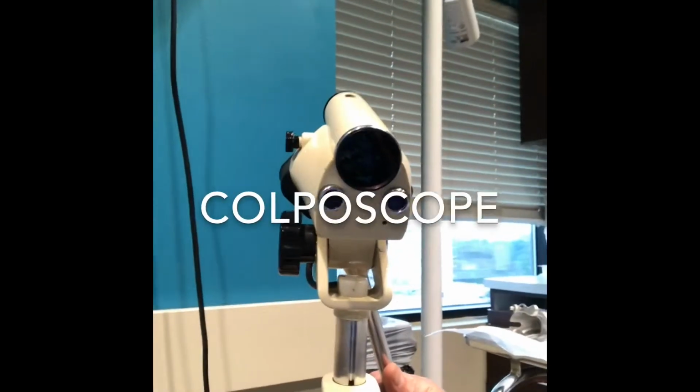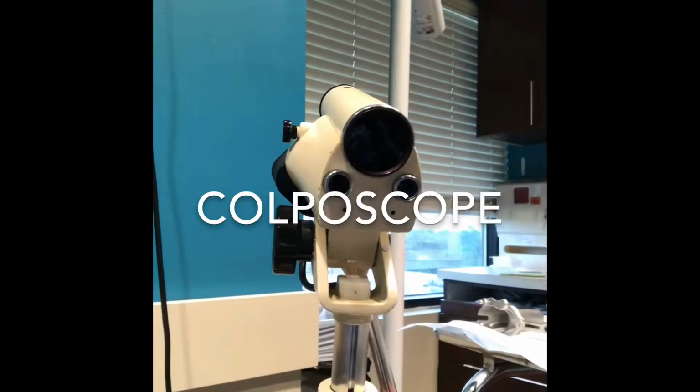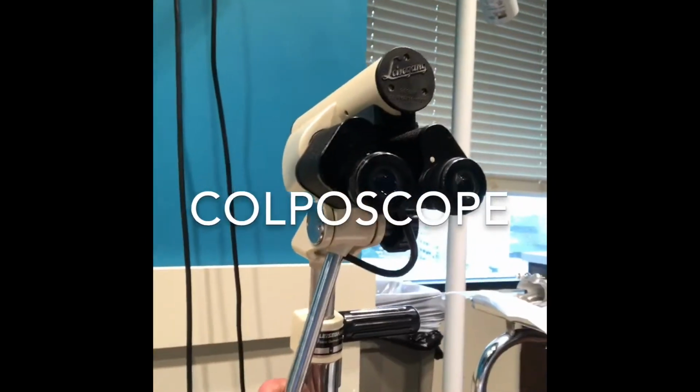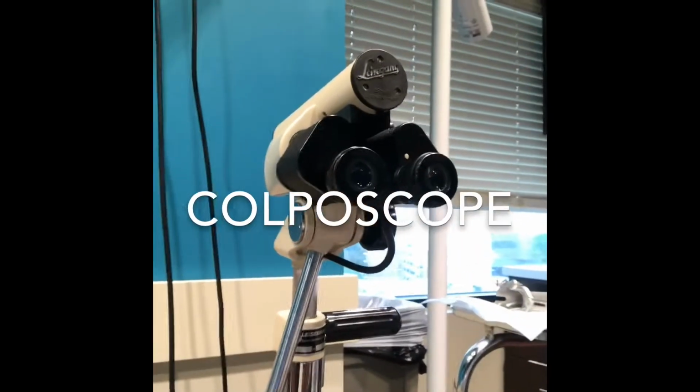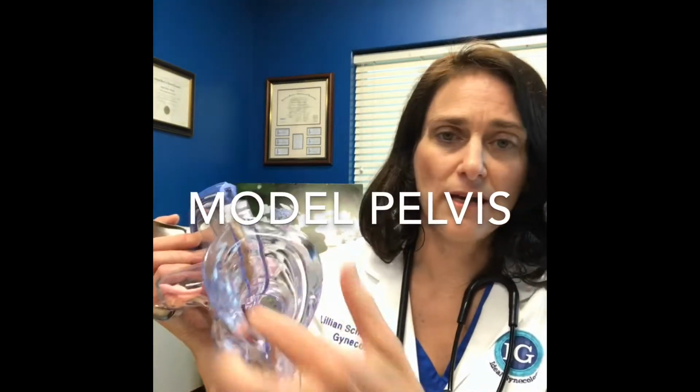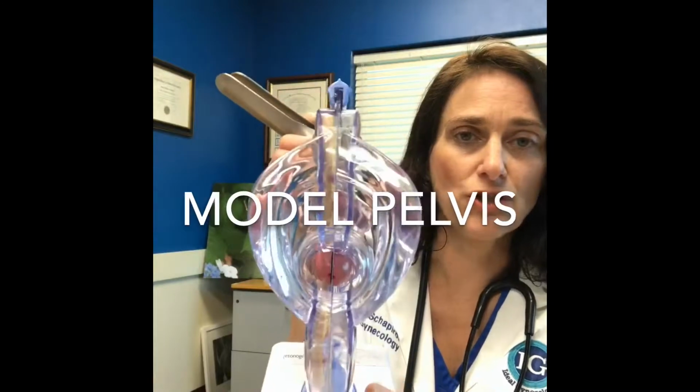This is a picture of a colposcope. So this is the part that's looking at you. Looks a little bit like a robot, but really it's just a fancy microscope. And then this is the part that I look through. This is the uterus right here, and inside here you can see the cervix.